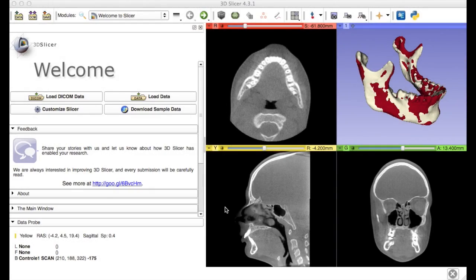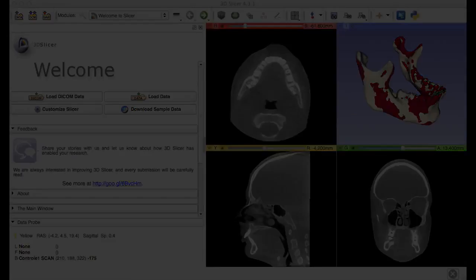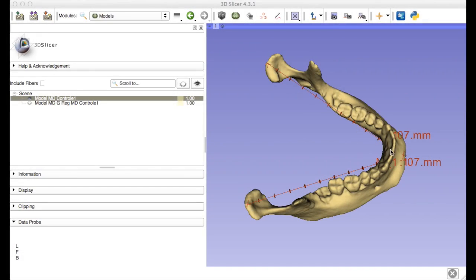3D images such as cone beam computed tomography can improve the treatment planning and follow-up with superimposition methods. Sometimes, 2D measurements on 3D models or X-rays show no difference comparing two sides of one structure. A lack of difference could be accurate, or could be due to incorrect placing of landmarks or anatomical variations.